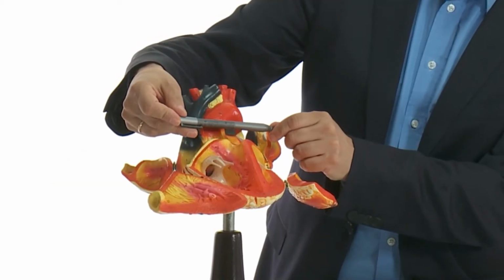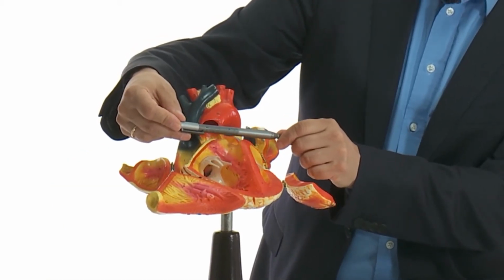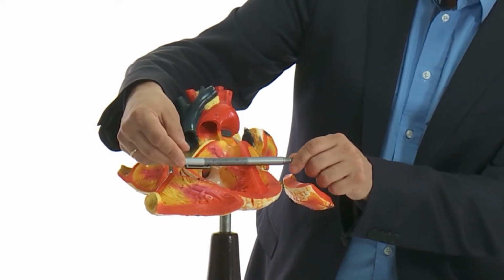That's completely true. And let me show on the model which structures we meet. We start here at the level of the aortic valve, just a little bit below the great vessels. And then we sweep downwards. We hit the mitral valve and the more medial and distal parts of the septum. But isn't it sometimes difficult to hold the image?